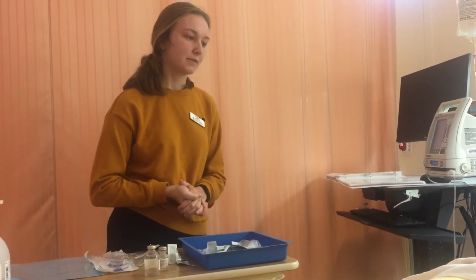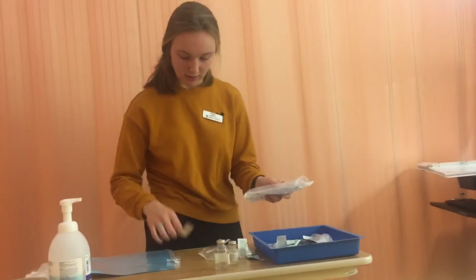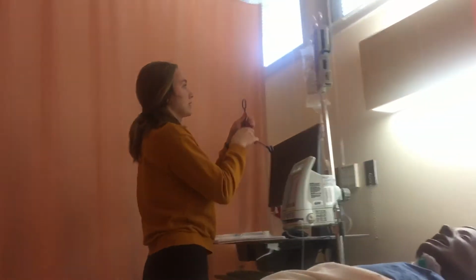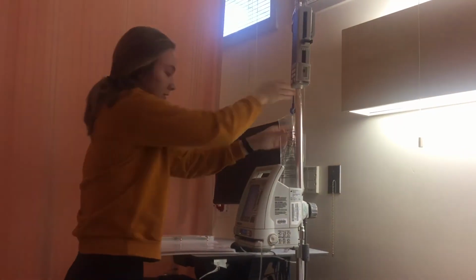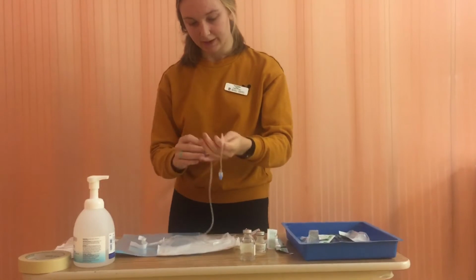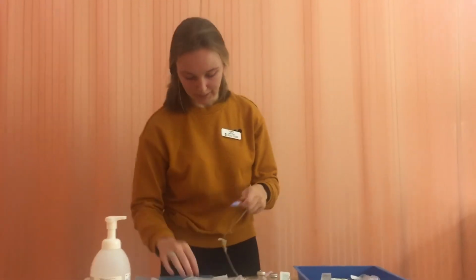Right now you have the right to refuse. Would you like to take this medication? Yes? Okay, sounds good. So now I'm going to get my secondary tubing. I'm going to remove it from the packaging, and I'm going to lower the primary bag. So I'm going to put the primary bag on and lower it, and I'm going to get the secondary tubing, and I'm going to attach my med label right away, just so the other healthcare providers know when the tubing was used. I have the time, date, and my initials on it.